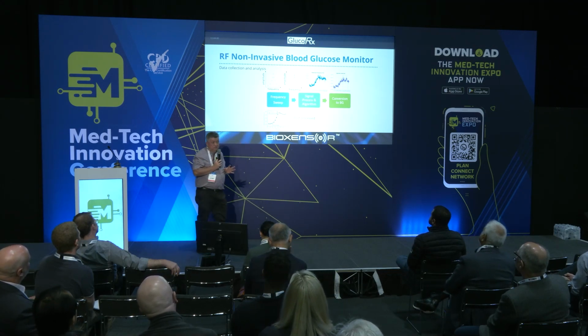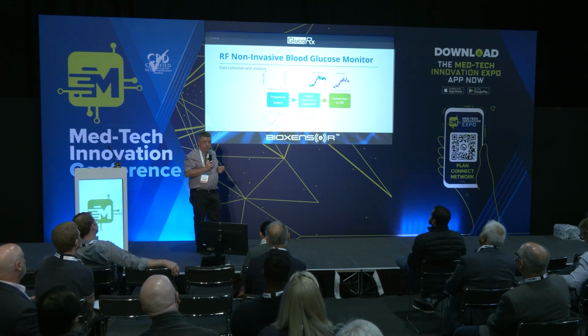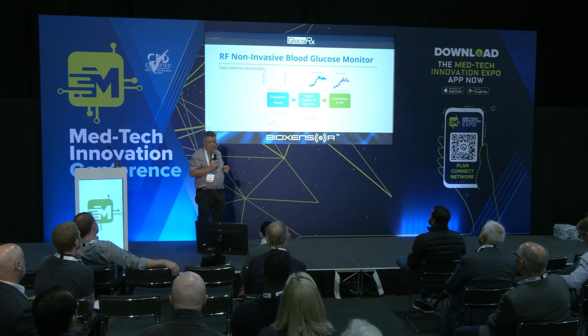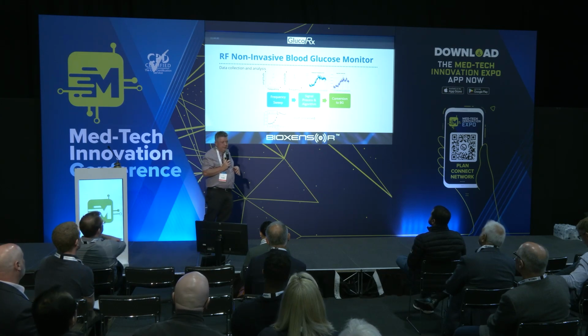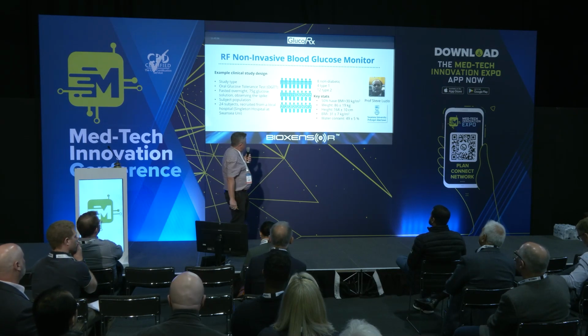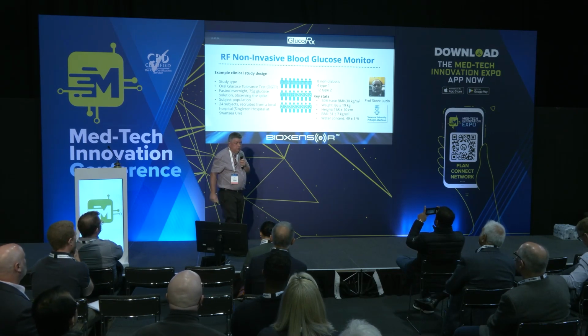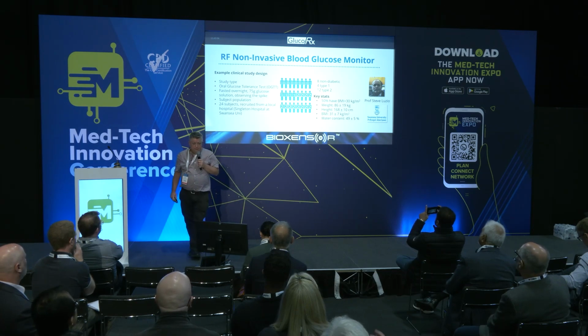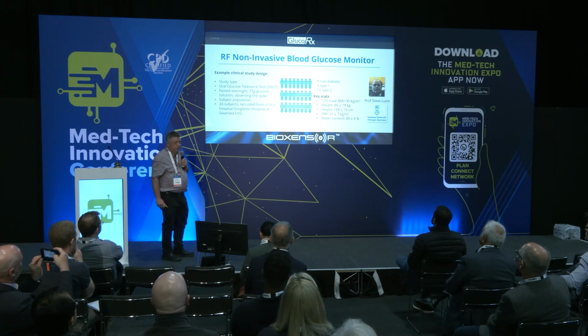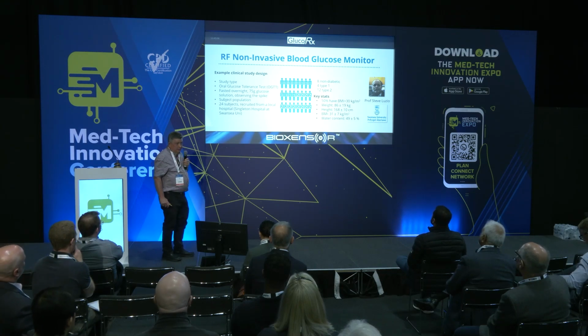So we know gold standard what the blood glucose is at any instant in time, because we use something called the Yellow Springs instrument blood glucose analyzer, which I think is the gold standard for these types of measurements. So we thank Steve Luzio, who's one of our colleagues, was at Cardiff, but now is a professor at Swansea. They've got an excellent clinical trials unit down there. So he does the clinical.